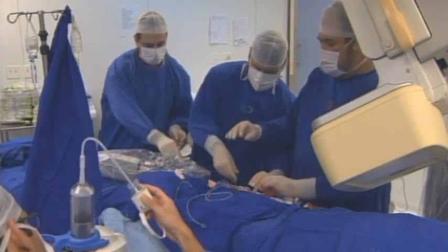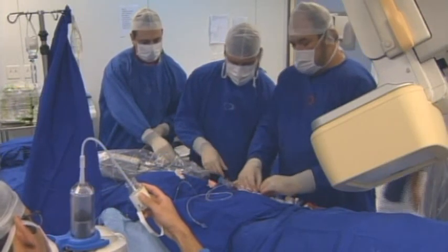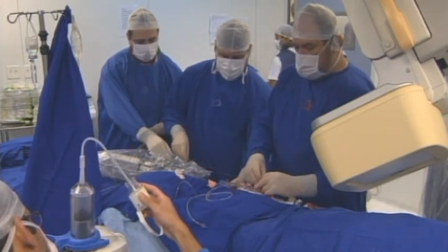Generally, when I use one stent, I want to use the same for all the vessels. Even when I choose a DES, I try to choose the same for all the vessels. But as a rationale, it makes sense.